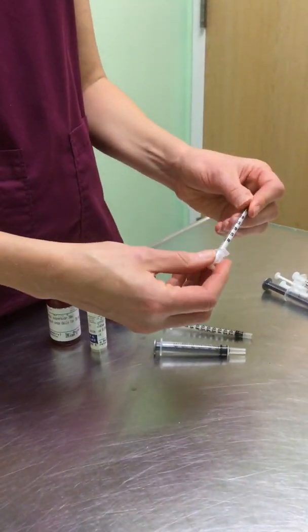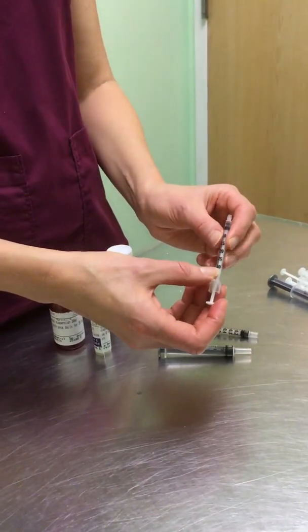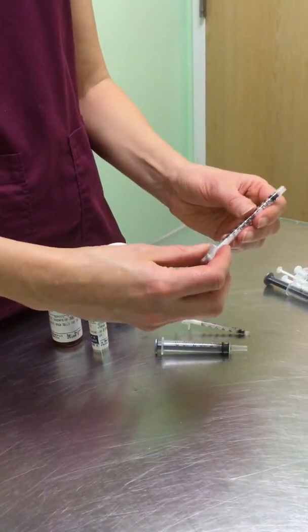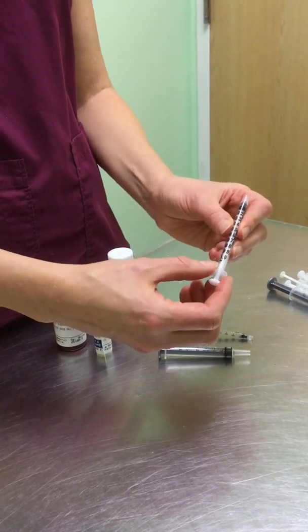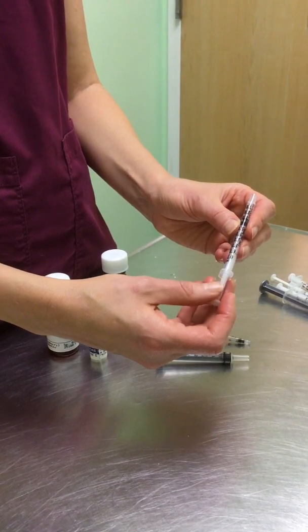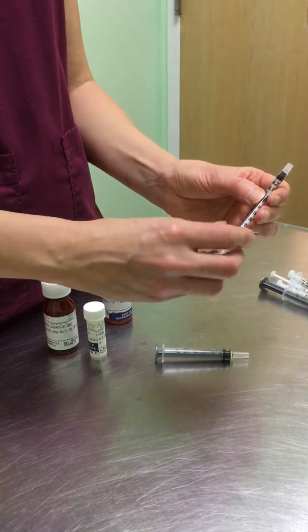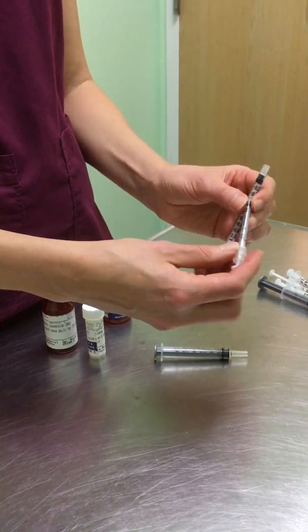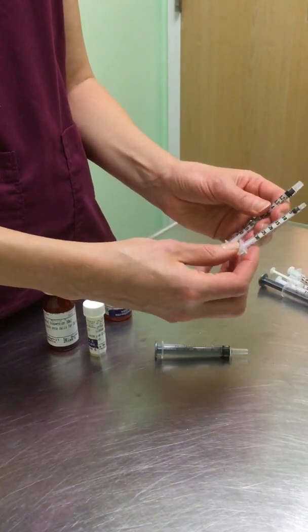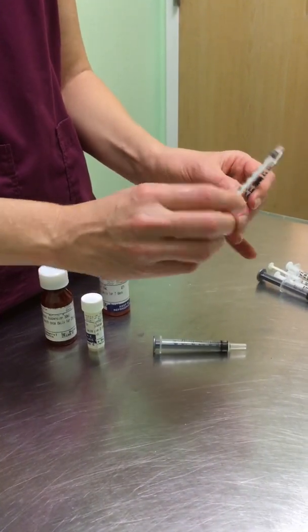Our smallest ones are insulin syringes with obviously no needle. These are measured in units. This is a 30 unit syringe. The next size up from there is a tuberculin syringe. It has 1 ml. Just for reference, 0.3 mLs is the same quantity as 30 units. And these syringes actually do tell you that. It says 0.3 mLs on it. But just for some reference, that's how big the syringe is. This whole syringe is only 0.3.